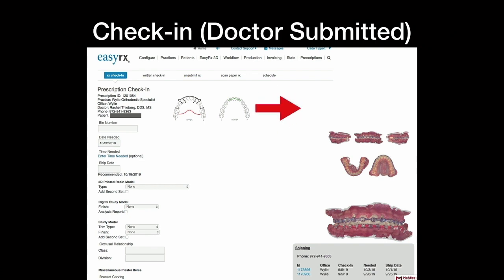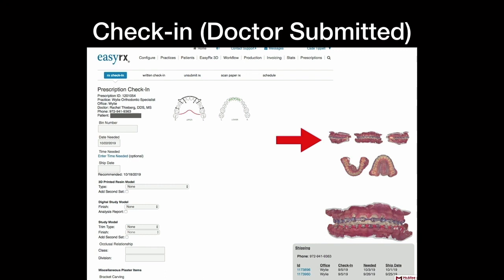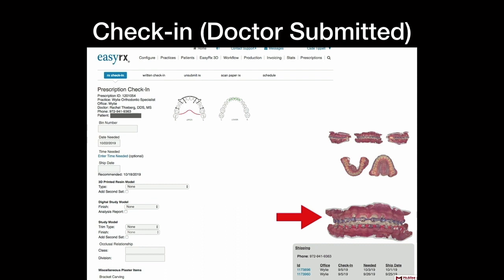So you see the prescription, and of course my favorite is this is the iTero integration. So when the doctors are filling out the EZRX prescription, they put the iTero ID, and EZRX goes into MyAlignTech, pulls those scans, and puts them in that script. So I don't have to sign up for MyAlignTech or 3Shape or any of those services, because EZRX goes and gets all the files for me. So you can see, you know, occlusal, the different views. Notice the brackets, that's going to come in a little bit. You can see a preview of the scan.